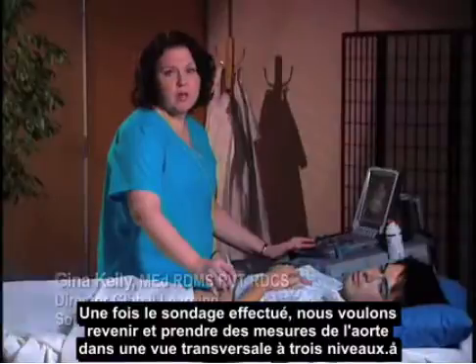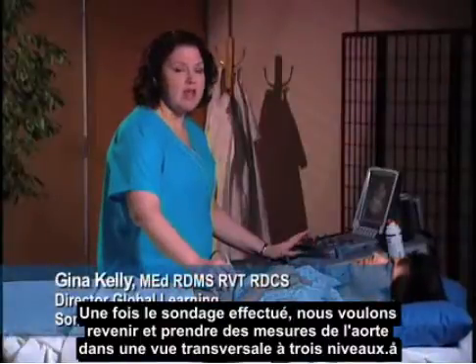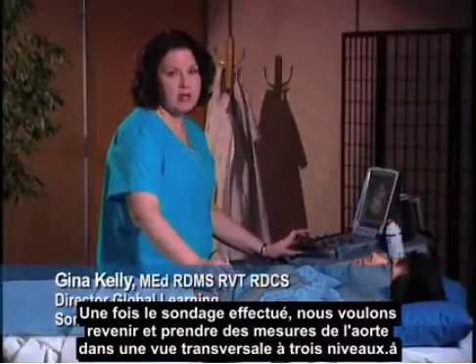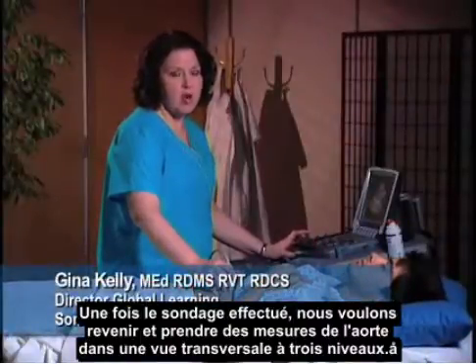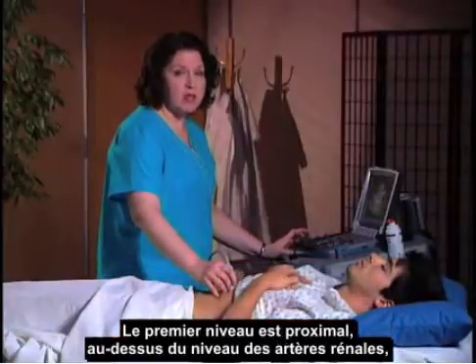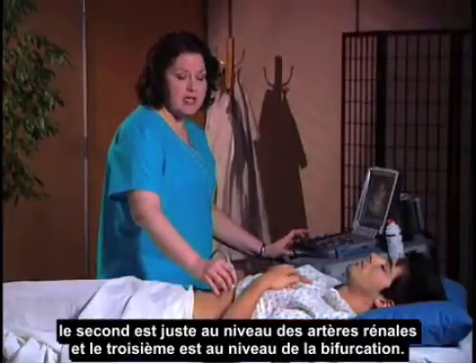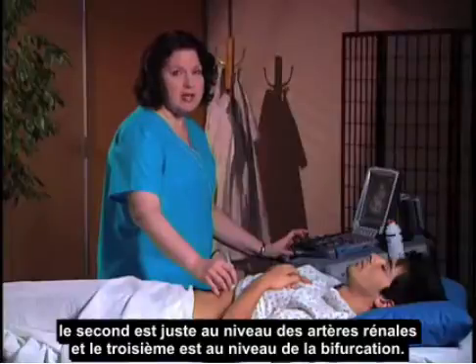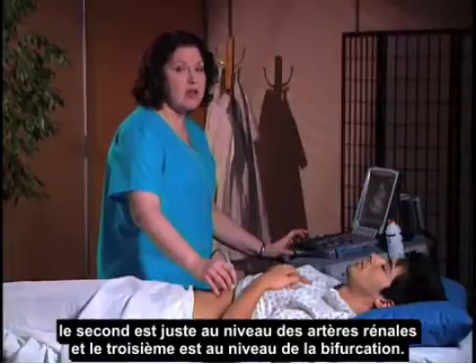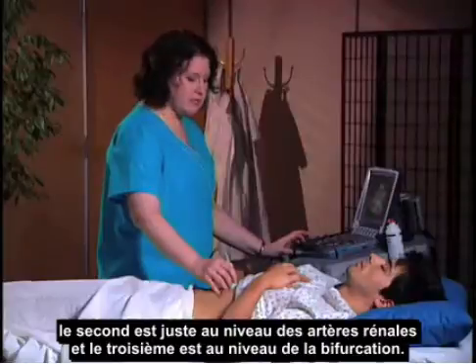Once we've done the survey, we want to go back and take measurements of the aorta in a transverse view in three levels. One level is proximal, above the level of the renal arteries. The second is just at the level of the renal arteries, and the third is at the level of the bifurcation.